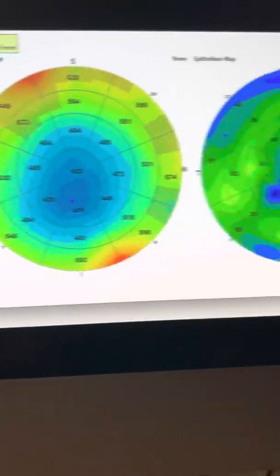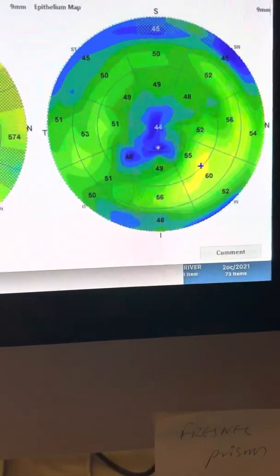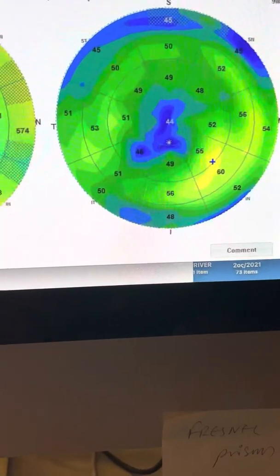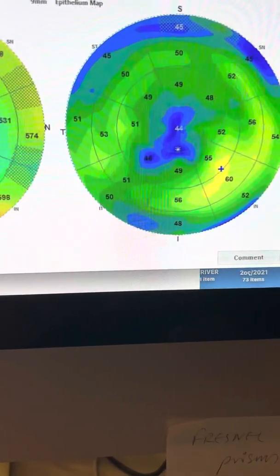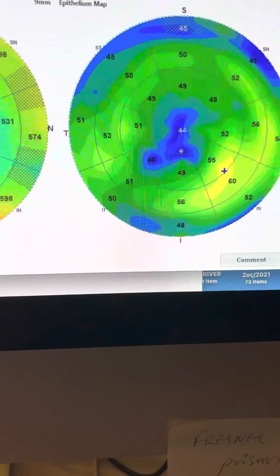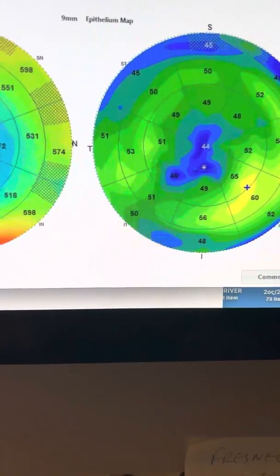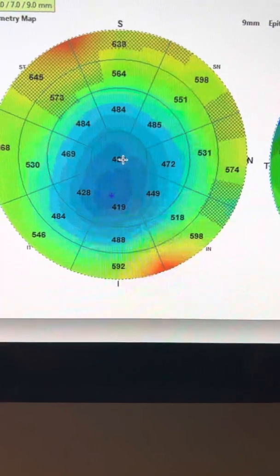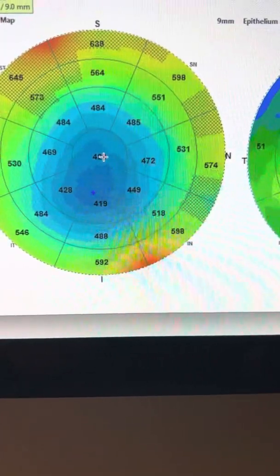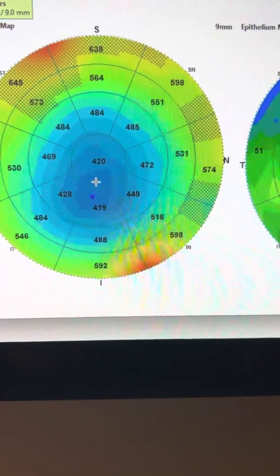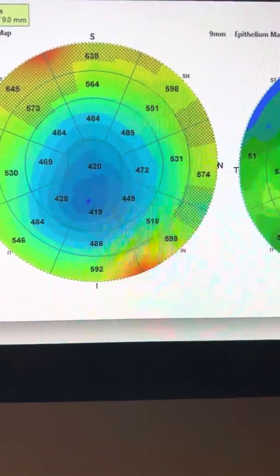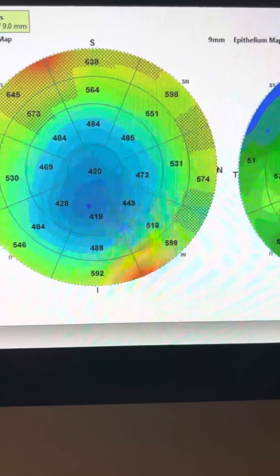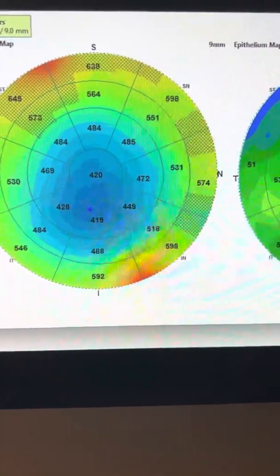Now, this is his images with us today, showing that the epithelial has changed quite a bit. And the central cornea thickness is less by 53 microns. So at least 53 microns were treated with a laser. And apparently, what we feel is that probably a PTK was performed, or a regular treatment based on the refraction, as the topography has not improved much.